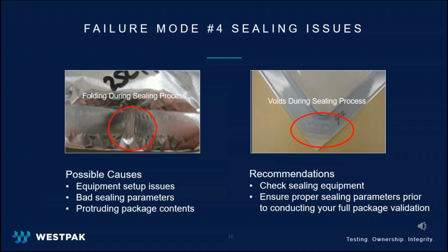The last gross leak testing failure mode I would like to talk about is sealing issues. As you can see on the pouch on the left, there are a lot of creases in the seal. This can be caused by folding of the material during the sealing process. The contents inside the pouch can also cause this by shifting into the sealing area during the sealing process.